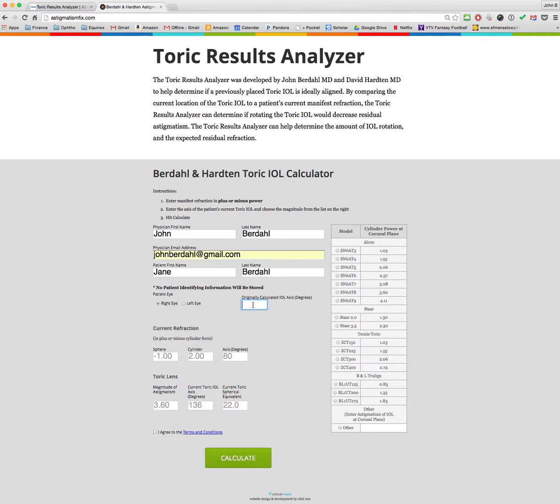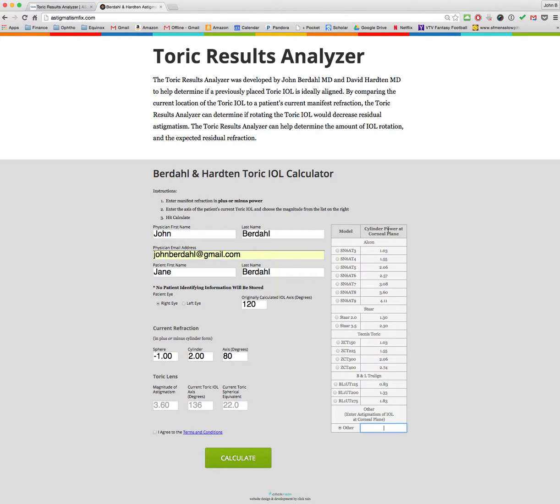In this case, we will choose 120 degrees and enter the manifest refraction. This can now be in plus or minus cylinder, and it will convert it for you. Here with the magnitude of astigmatism, you can enter any number you want in either box — that's particularly helpful for international colleagues. For those in the United States, all currently available toric lenses are listed by their cylinder power at the corneal plane, not the IOL plane power. For example, the SN6AT9 has 6.0 diopters of power at the IOL plane, but at the corneal plane it's only 4.11.